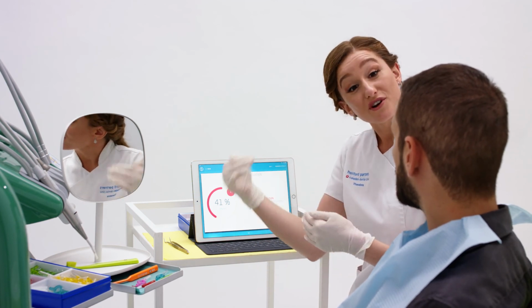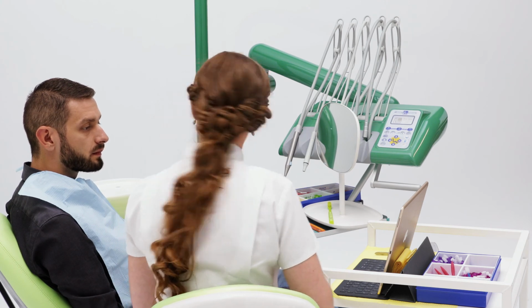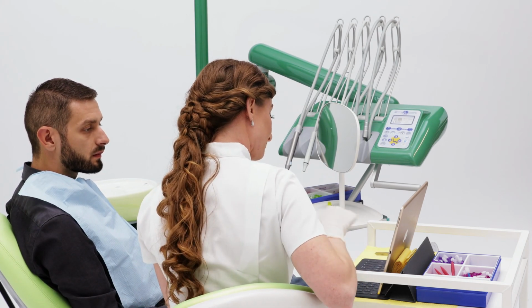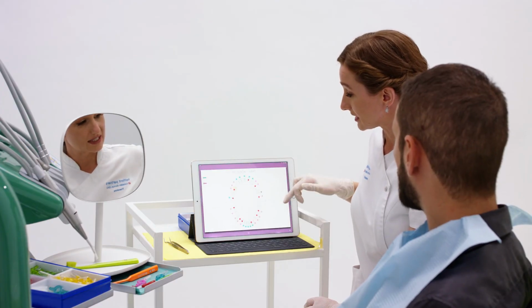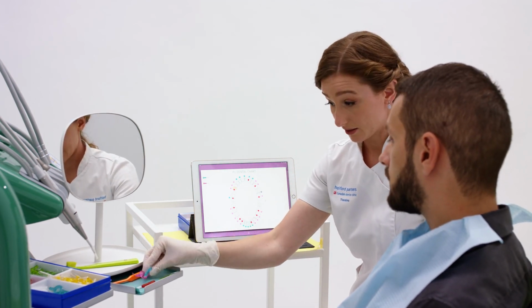I then show Edward where we would view his past and present Bob scores. His full mouth map is also viewable to take a final review and remind him that this is the image he can use at home to support him in using his interdental aids.